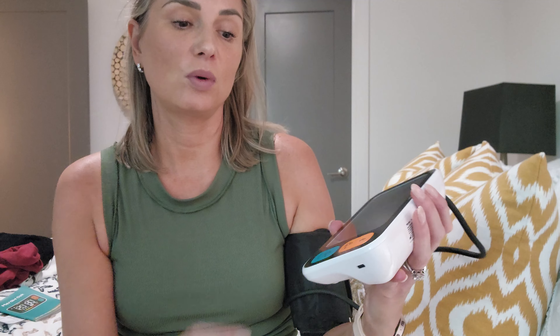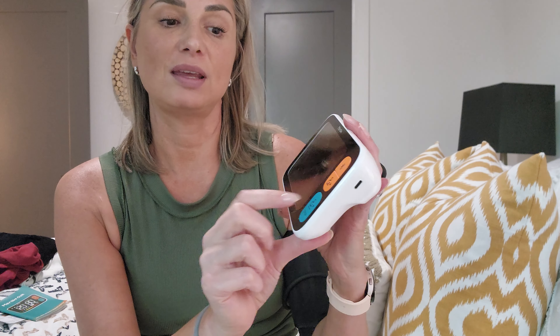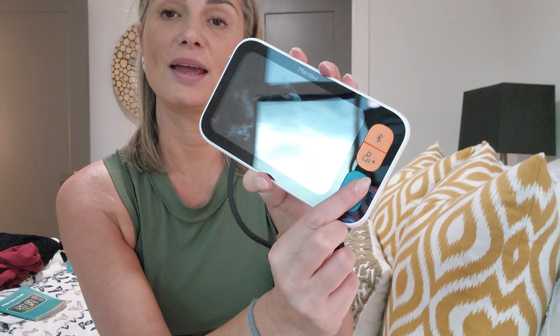I'm going to sit down and test my blood pressure so you can see how it works. I'm sitting in the bed with the blood pressure cuff on — it's Velcro. I do have a smaller arm but luckily this fits very nicely. With the screen off, you'll want to push the A button if you're User A, so we're going to do that and let it go.